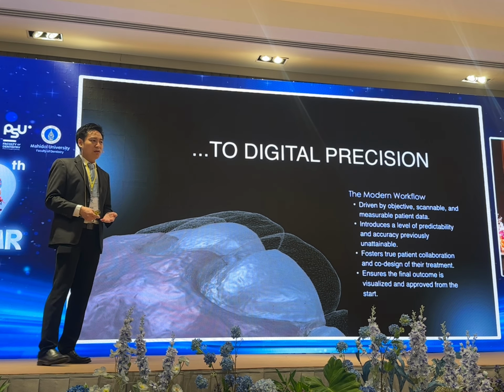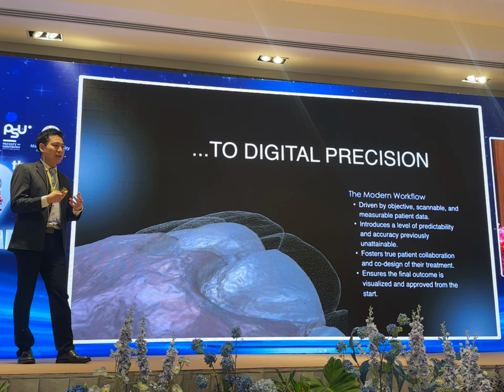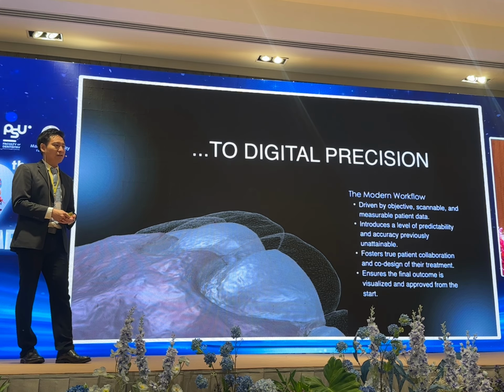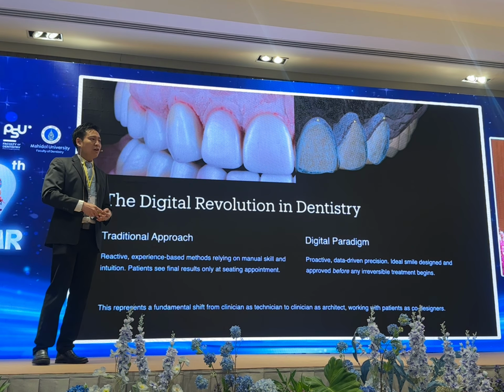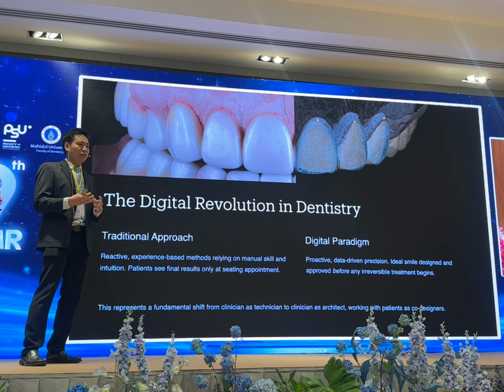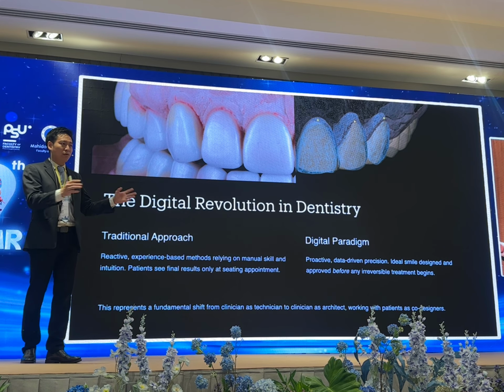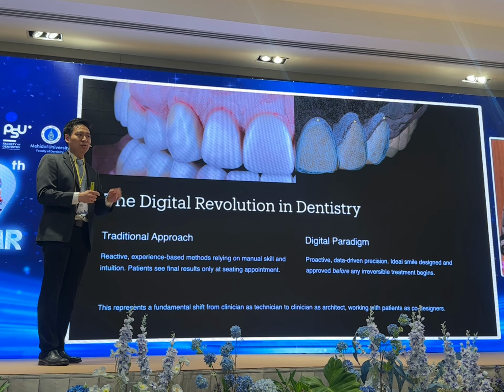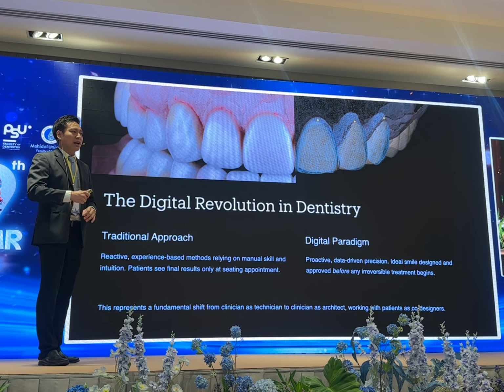We can use extraoral photography to collect how the patient smiles, how they speak, how they talk. With a couple series of extraoral photography with the intraoral scanner, you can collect all of the information you need. In comparison with traditional, the digital way makes you feel like you have your patient right next to you at the unit, even if the patient has already gone home. Some information that you may think you missed during the oral examination, you can come back and take a look at again. So it makes our workflow easier.